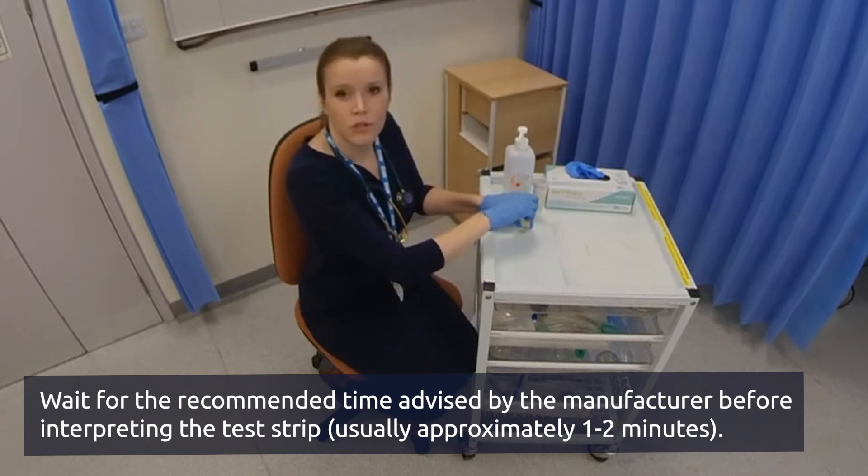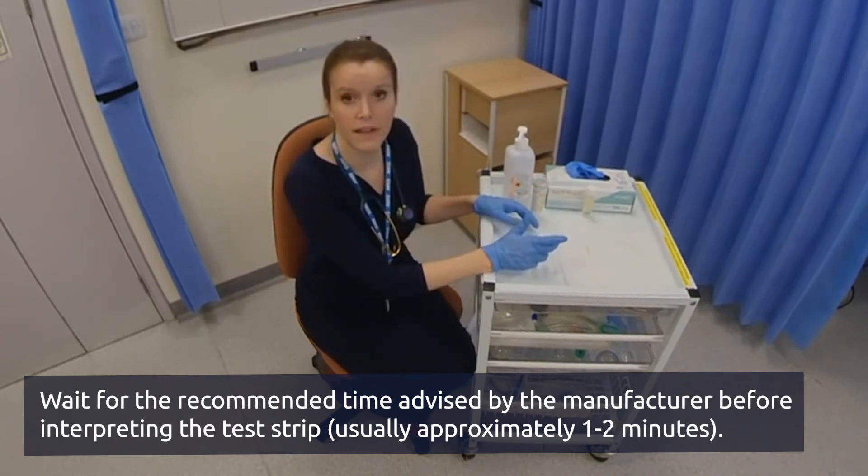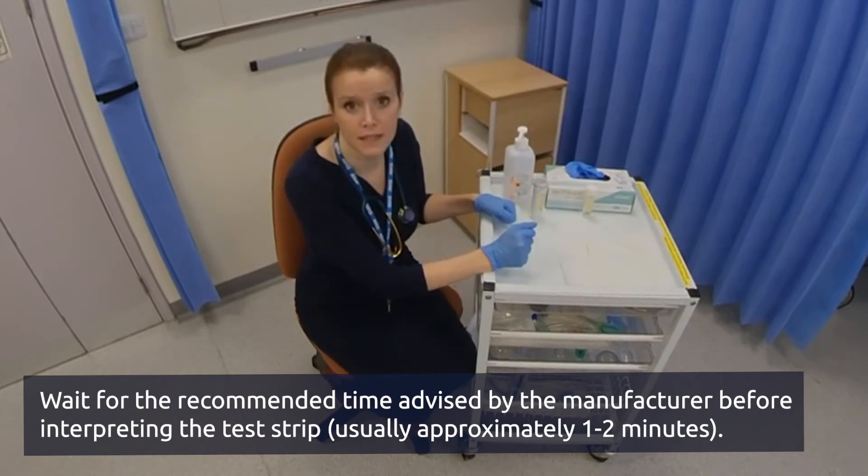It is also important to wait for 60 seconds, as some of the squares take longer to develop. For example, protein takes 60 seconds.